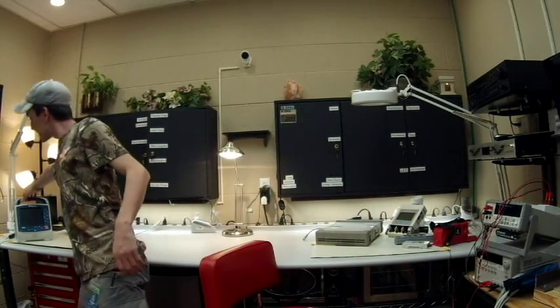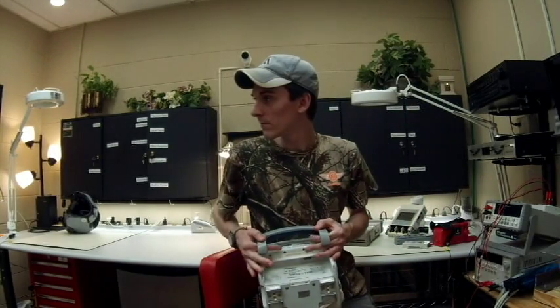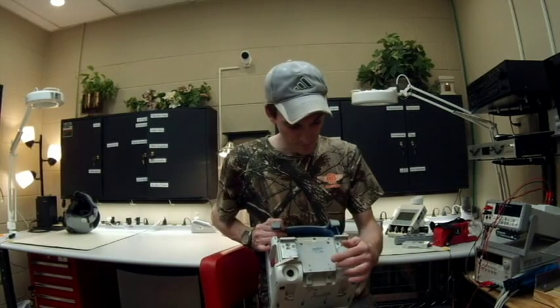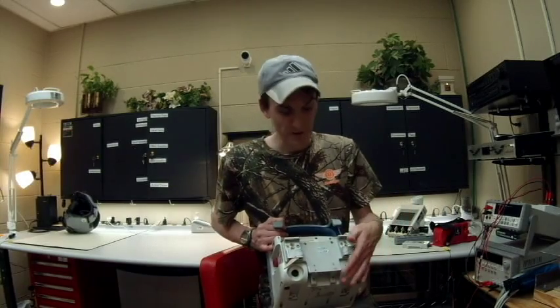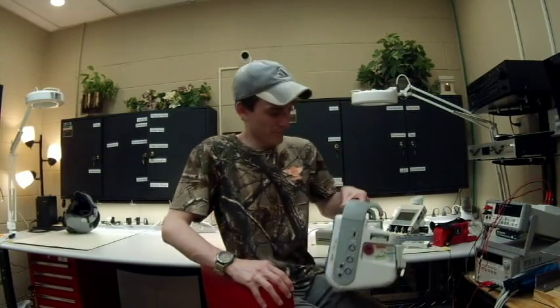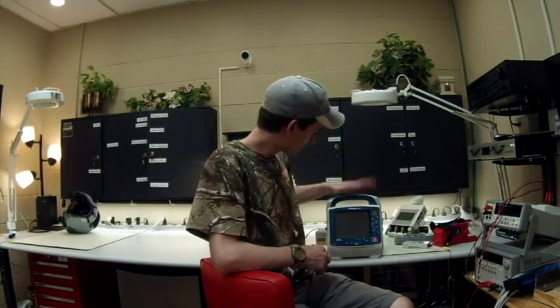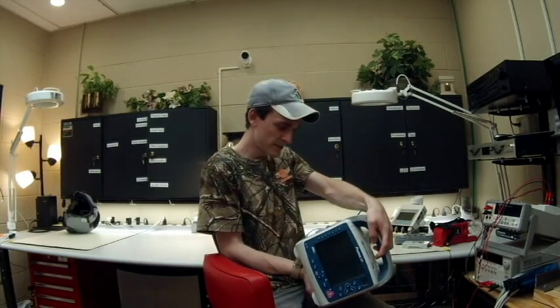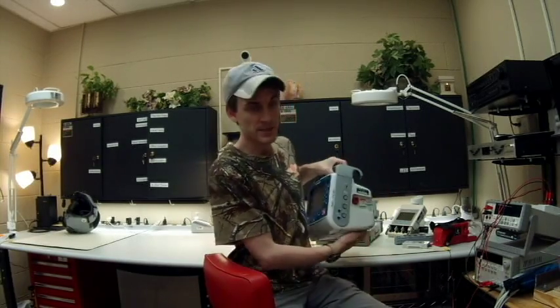Last but not least is our defibrillator unit — technically it's a multi-parameter monitor. It does various things: ECG, SpO2, NIBP, CO2, IBP, defibrillation, and pacemaking. It does anything you could possibly want, literally.